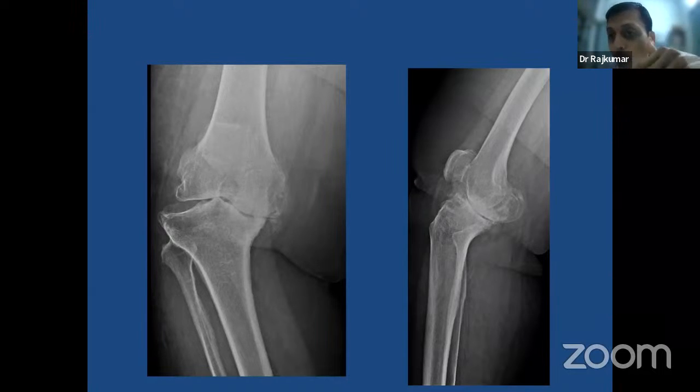Even if this case doesn't get much flexion post-operatively, don't worry too much. But you cannot keep too much slope in this. The more slope you keep, the more difficult it is to balance this knee. Keep that in mind. Another important point I would like to tell is, try to keep the cuts minimal when you are beginning. In this case, start with a minimal cut. Whenever you need more cut, you can revisit and cut it, but keep it minimal. In that way, you can balance it.